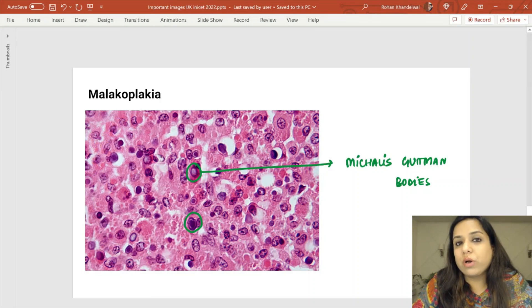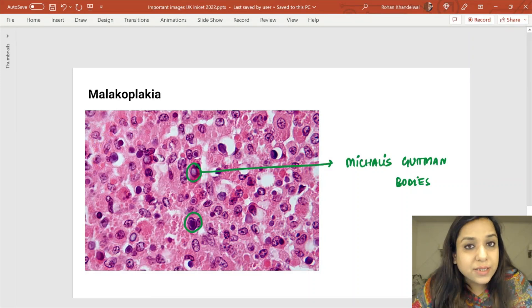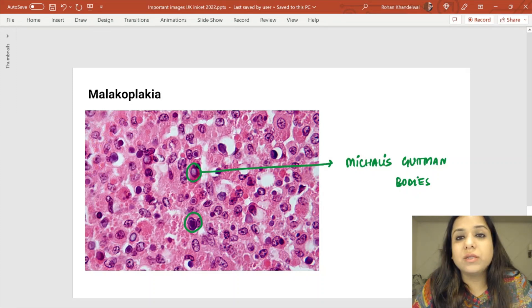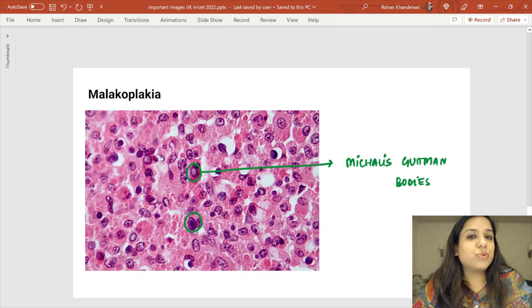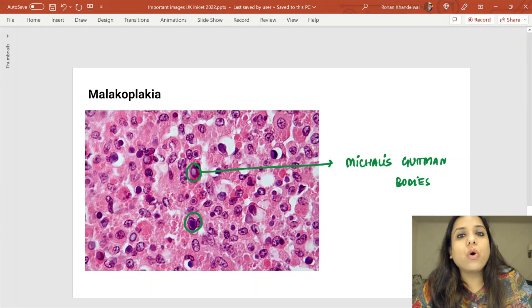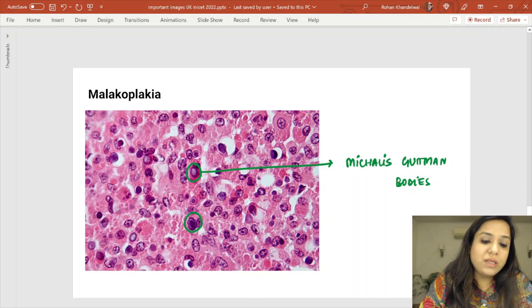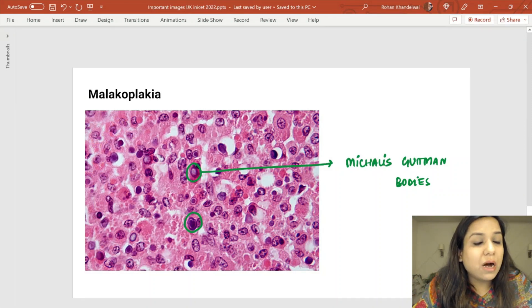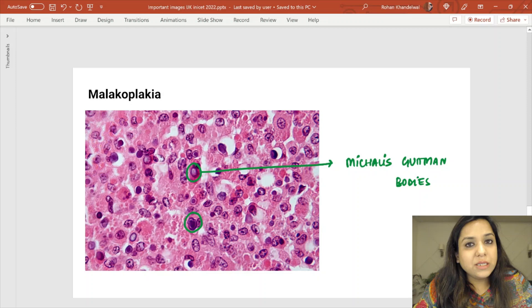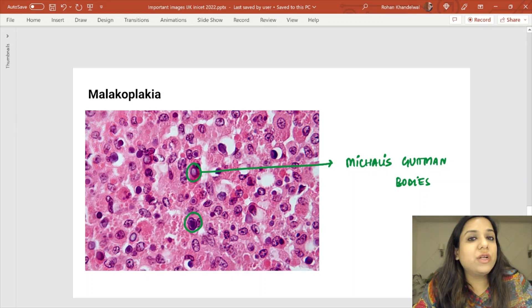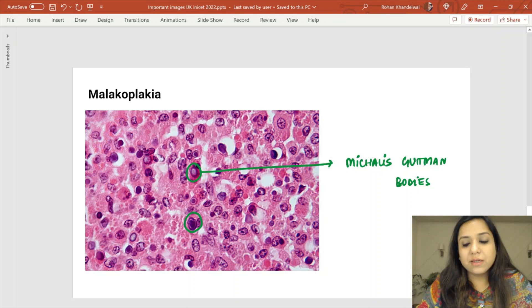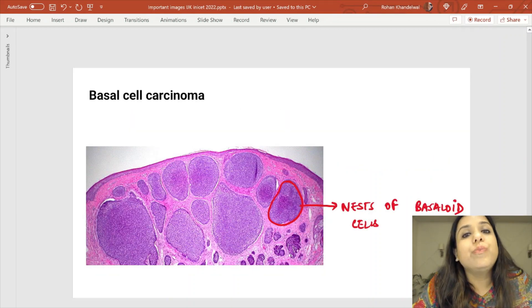This was a spotter asked in the previous INICET exam. There was a history of a patient with a yellow colored plaque in the urinary bladder. The diagnosis is malakoplakia. You can see basophilic concretions marked in green — these are Michaelis-Gutmann bodies, which are the characteristic feature of malakoplakia.